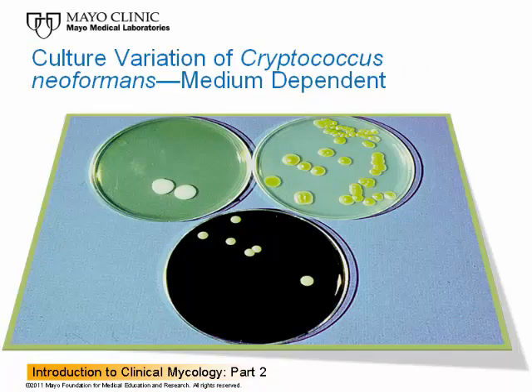This is an example of something that is important for you to remember in the clinical laboratory. Not only are you faced with which media to use for recovery, but once you decide which ones you're going to use, you must become familiar with the morphology of the organisms on those particular media, because they can look different depending on the medium.